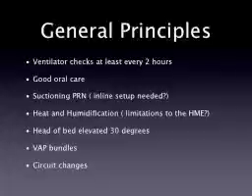It also maintains a pressurized system, and there are certain patients that are highly dependent on PEEP for oxygenation, and every time we disconnect the circuit and suction them, of course, we risk potential de-recruitment of alveoli, so that's nice.